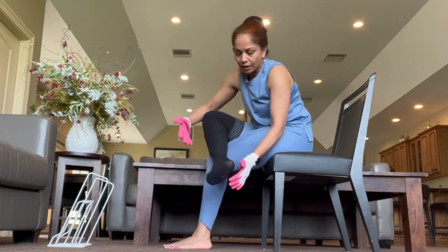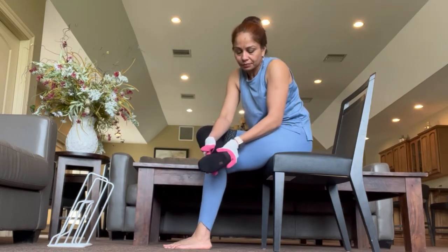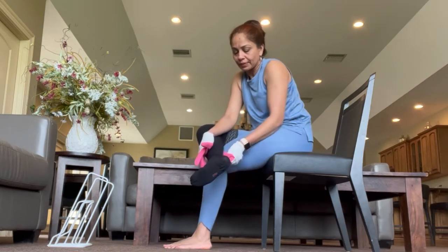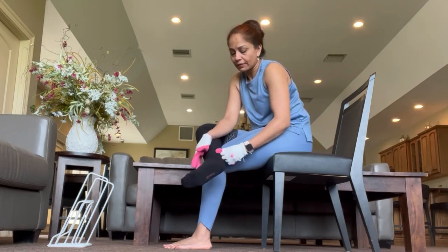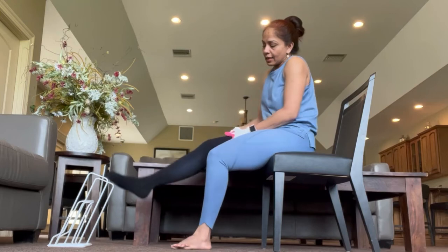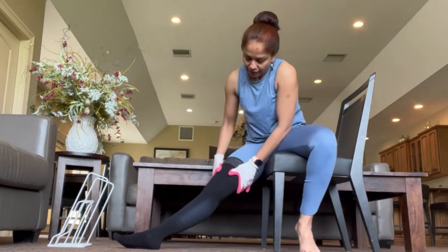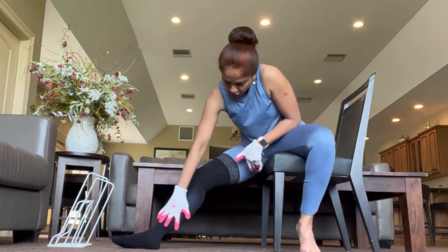Pull it up from the top, then work on the bottom and grab a hold of it. Note: these socks are actually a bit too big for me, which is why they're giving me a hard time — they slide when I try to pull. Just smooth out the fabric like this, and there you go.